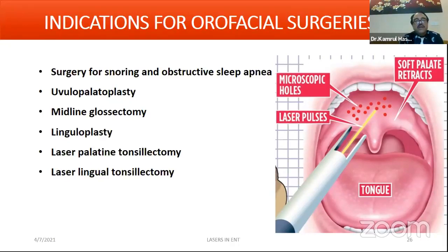In that case, nowadays tonsillectomy is indicated. In that case, tonsillectomy is better taken with a wide margin from the tonsil area. And in that case, a diode or carbon dioxide laser is a better option, because if these lasers are used, you are cutting like wax.